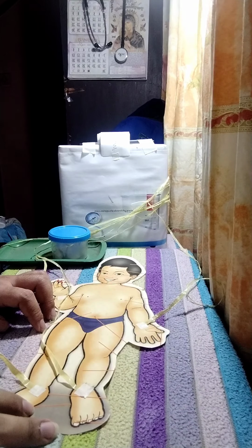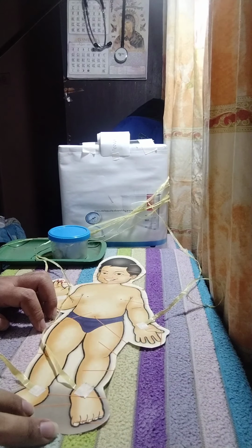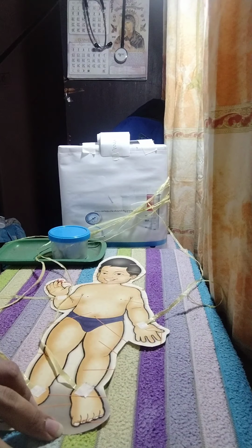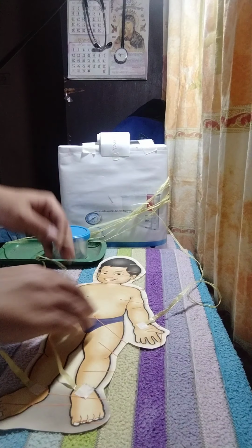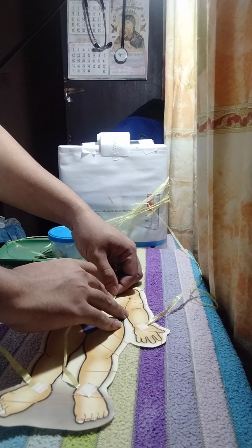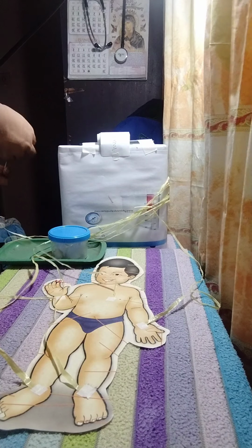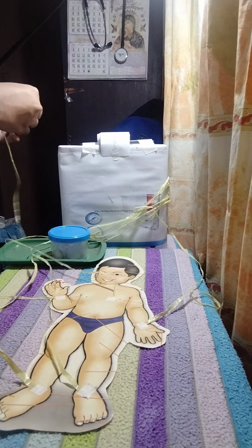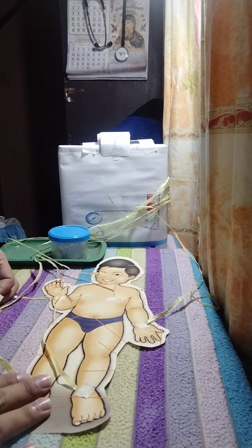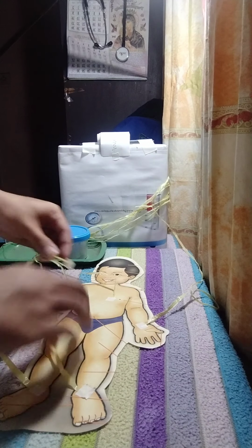Next, the position of each lead should be: V1, fourth intercostal space at the right sternal border. V2, fourth intercostal space at the left sternal border.